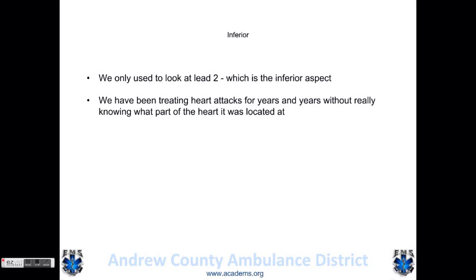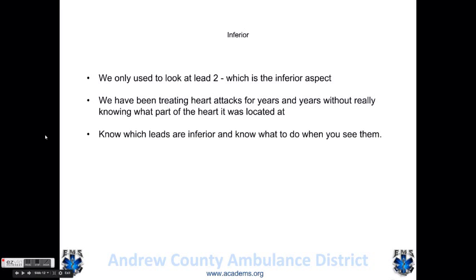So we potentially had all these years of treating inferior MIs, which an inferior MI alone is not a problem. If it's just an inferior, it's fine. But with a 12 lead, we do want you to know which leads are inferior and what to do when you see them.